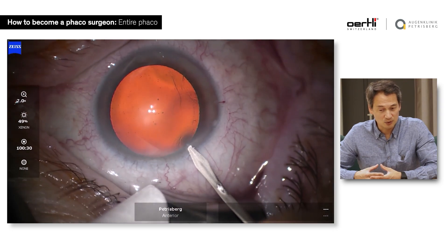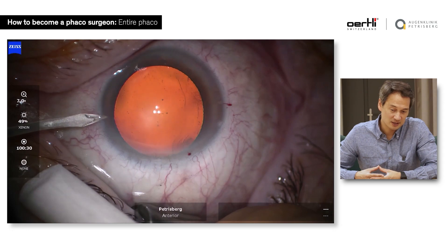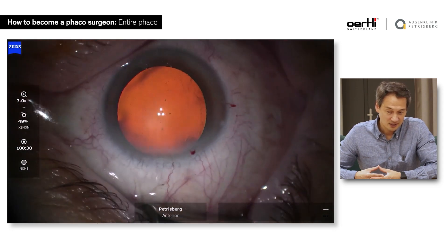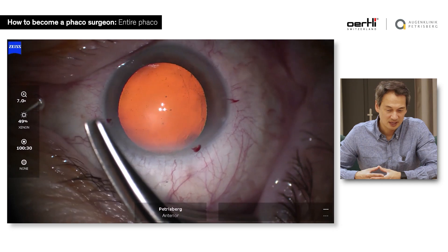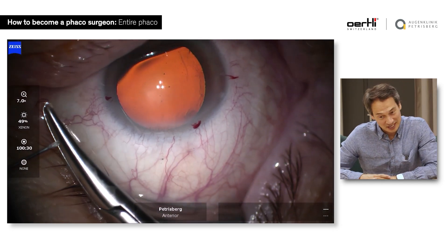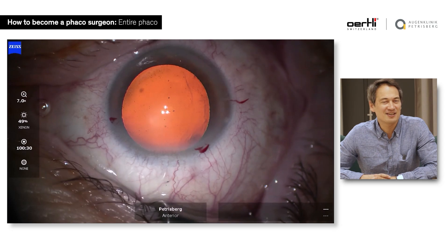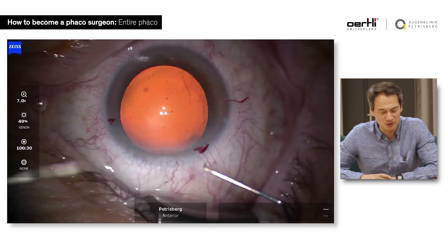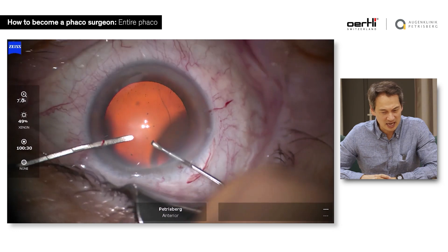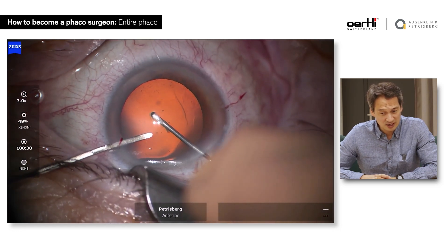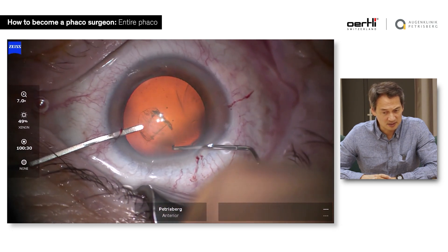They just need a nice OVD filling. Now look at the direction of the side ports — I'm aiming towards the contralateral angle. You can see some limbal bleeding, meaning that I'm not in very clear cornea, which is good. The cystitome we manufacture ourselves, but it's not necessarily important to do it yourself — you can use forceps or a cystitome, whatever suits you.